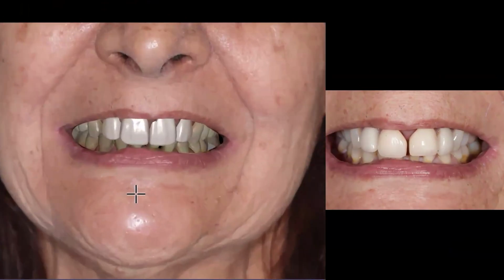Now, here's a case where the photography failed me. Sometimes you can take the best facial photo you can possibly manage to take, and you can work out your design, which I did in Exocad, but the problem is I only have one view of Karen. And the biggest miss when I look at this from the side is I really don't know what this looks like from her profile view.